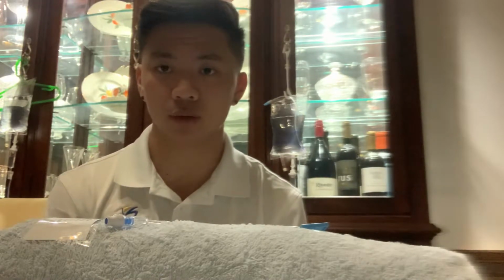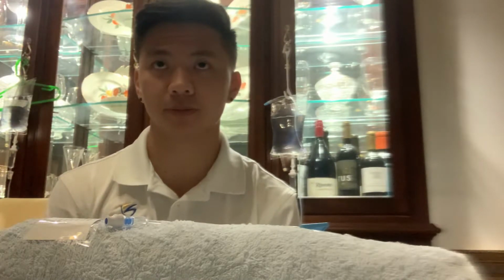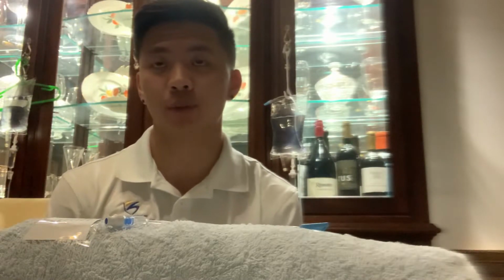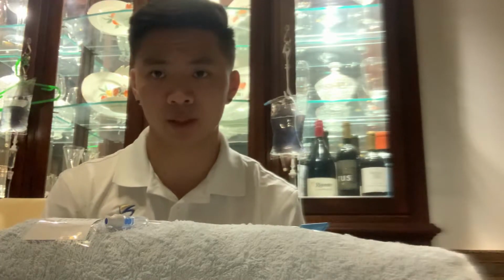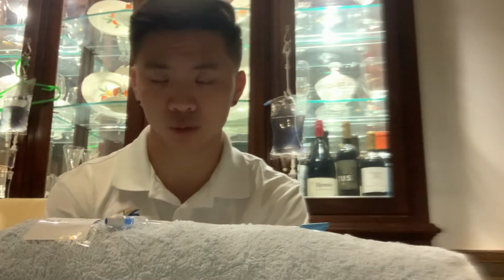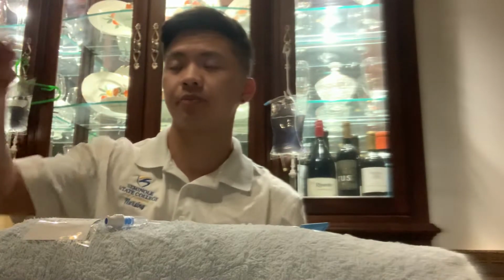So after I've gathered those materials, I'm going to go ahead and calculate the drip rate. So the drip rate is going to be the total volume of milliliters, which is 125, over the amount of minutes, which is 60, times the drop factor of the IV tubing, which is 10. So it is 21 drips per minute, which is calculated. I'm going to go ahead and perform proper hand hygiene.